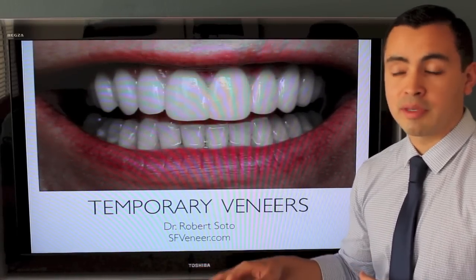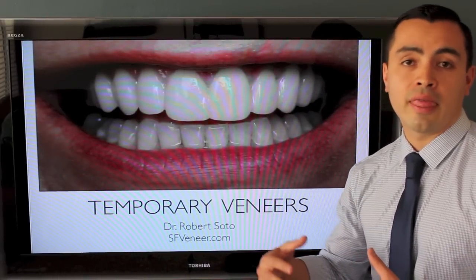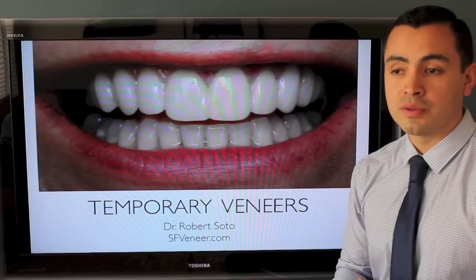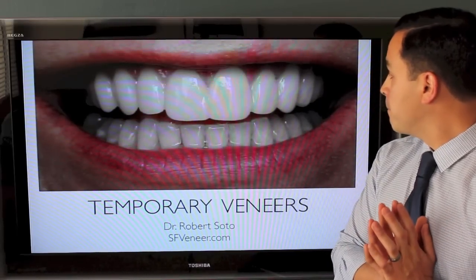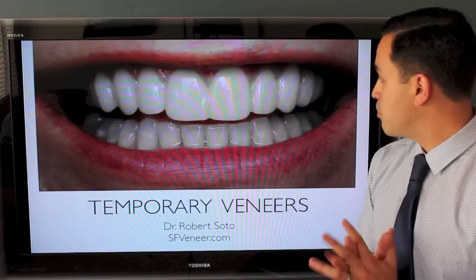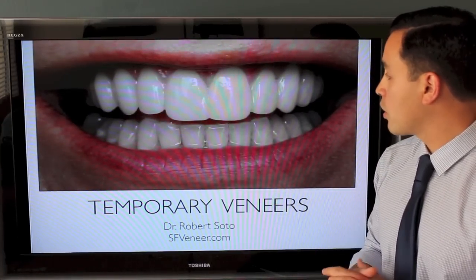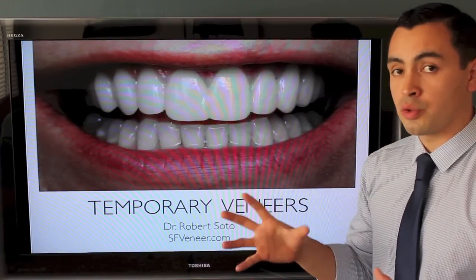We'll also decide on color, because I usually make the temporaries a lighter shade of teeth, and then the patient can decide whether they want their teeth even lighter or darker — so not everything has to be decided on that first day. In the final veneers you'll see we did change things just a bit: we decided to make the lateral incisors just a little longer and maybe flattened out the central incisors so they're not so rounded.